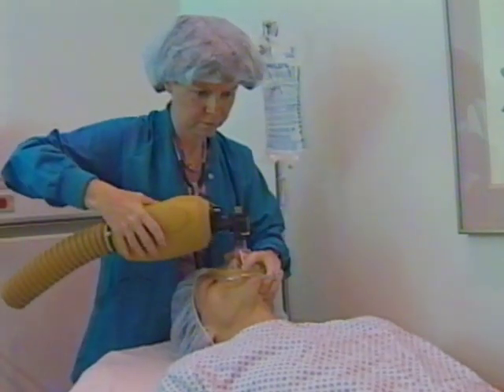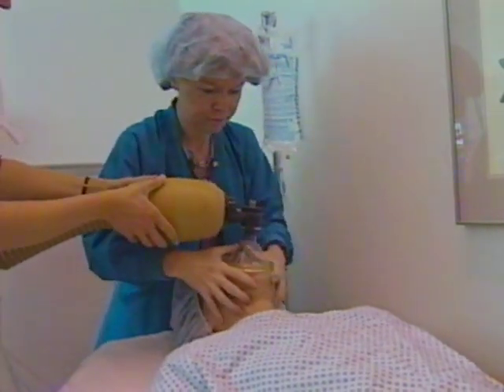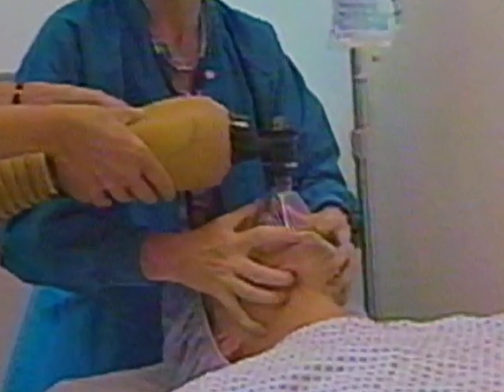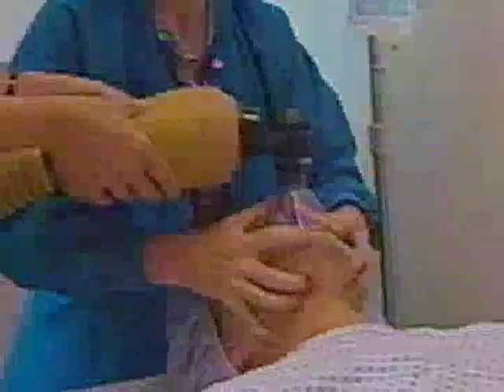You can often get a better seal by leaving both of your hands on the mask and having a helper squeeze the bag for you. Place thumbs on top of the mask. Place fingers on the bottom, bunching the soft tissue of the cheeks under the mask. Use your fingers to hook the bony mandible and pull it upward.